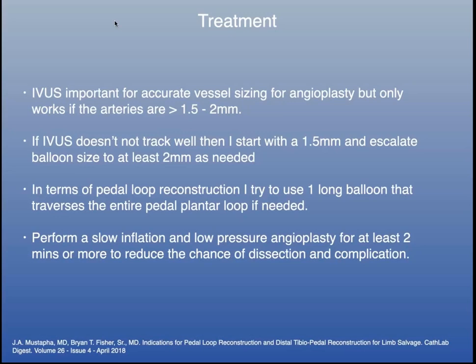In terms of pedal loop reconstruction, I try to use one long balloon that covers the entire pedal plantar loop if it's all abnormal. I think it minimizes your time, it minimizes radiation, it minimizes your risk of exchanges with multiple balloons and lengths and sizes, and hopefully will reduce your chance for dissection and perforation, because you're doing one long, prolonged low pressure inflation, which we know decreases the chance for dissection and complication.